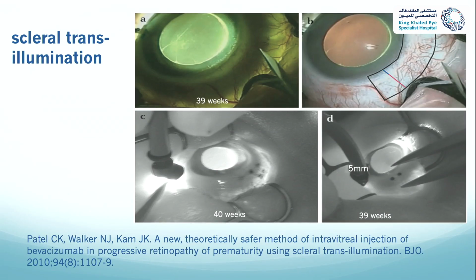This paper was published in BJO by C.K. Patel, and C.K. Patel is a consultant from Oxford. We had the fortune of working with him as a fellow in Toronto, so he was trained in Toronto with us. And he showed this scleral transillumination technique to estimate the locations of the pars plana.